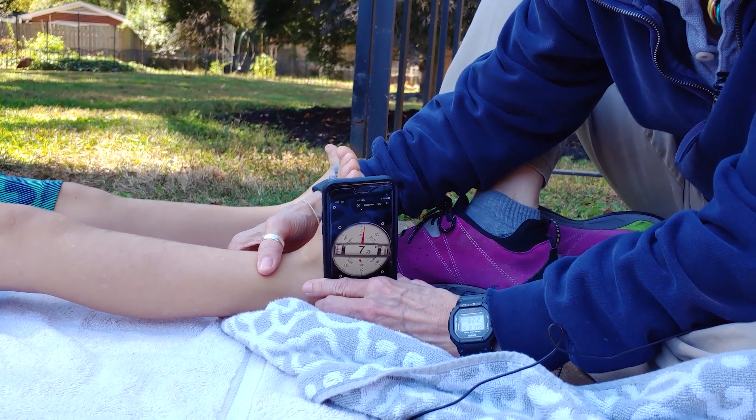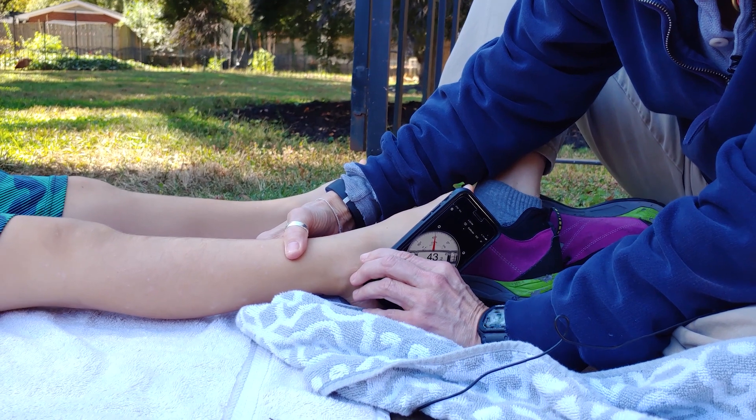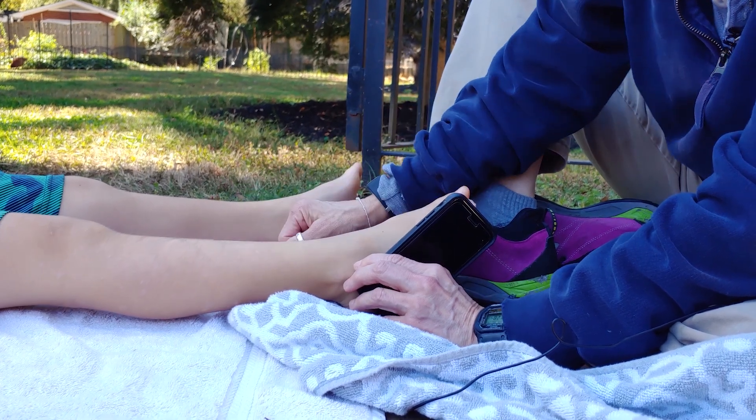When you push down, Sammy — see how far your foot can go down. And it's saying 47 degrees if I measure it with the clinometer, which is pretty good.